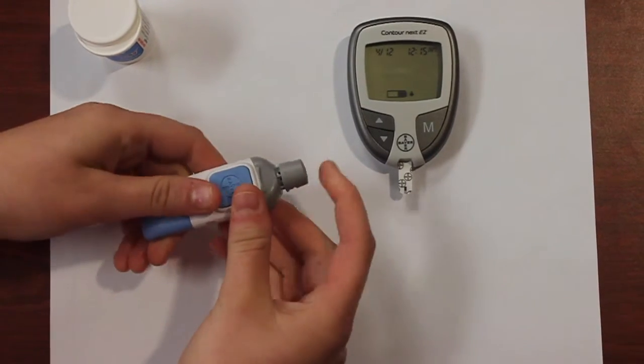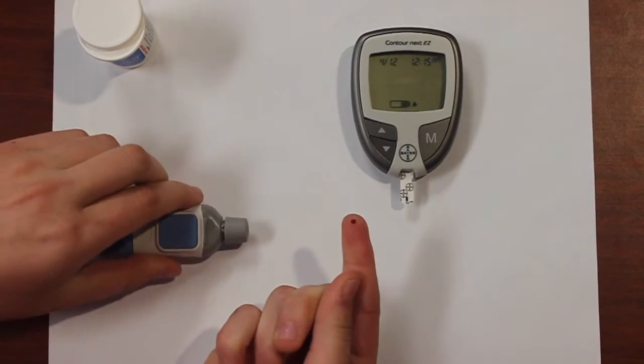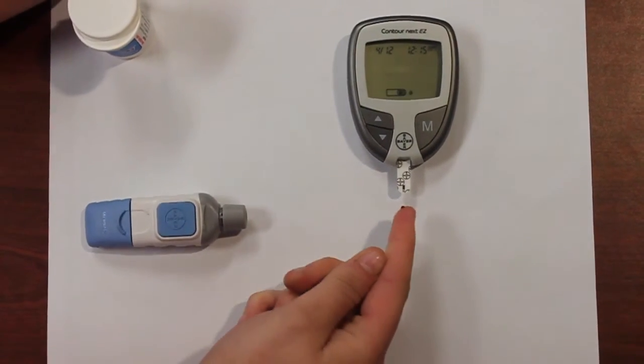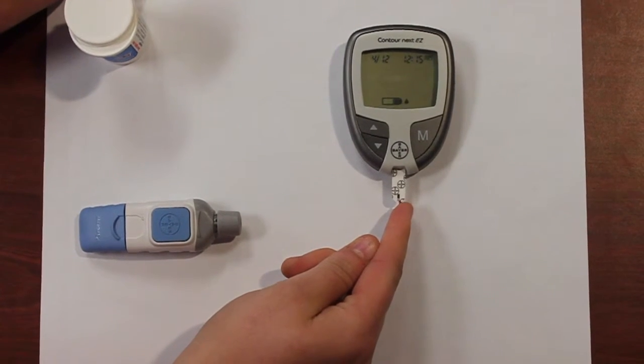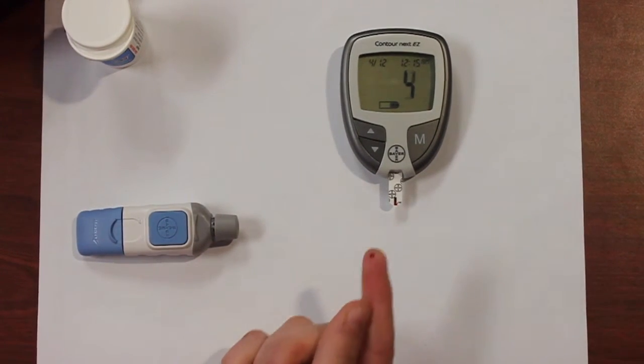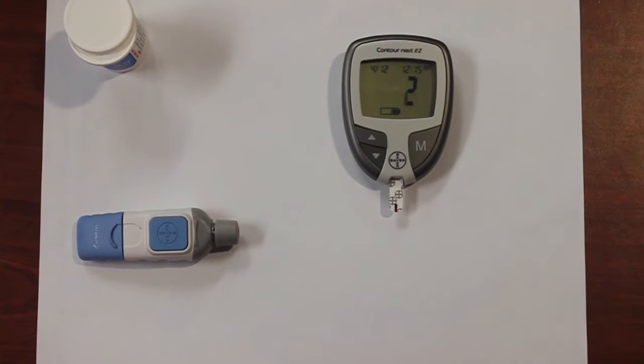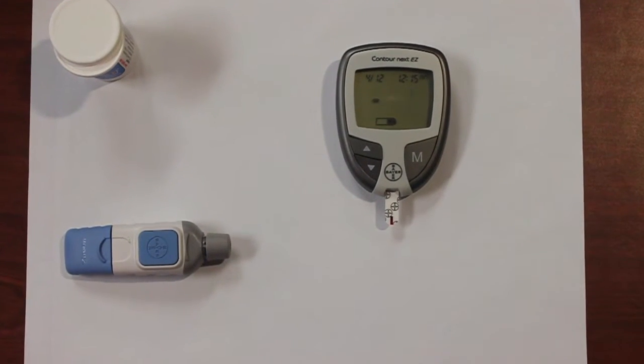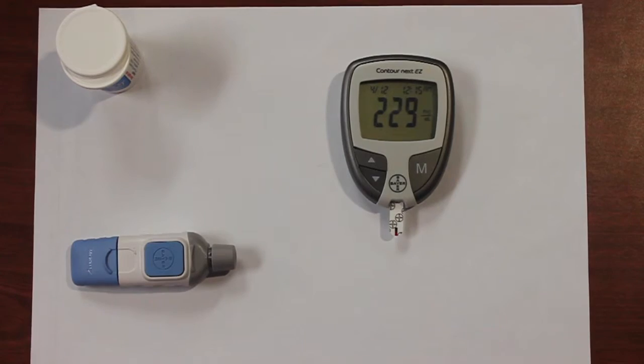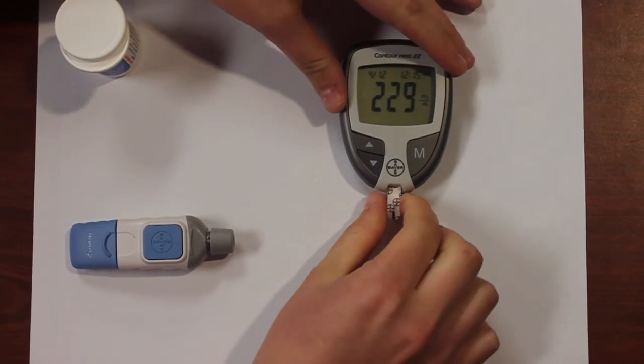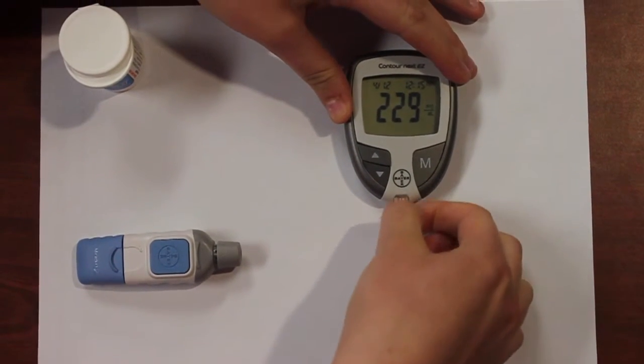Next, pull the trigger on the lancing device, press the button, and squeeze the blood onto the test strip. The test strip will pull the blood into the device, and the device will count down for five seconds before displaying the blood glucose. I'm also a type 1 diabetic, so obviously that blood sugar is a little high.